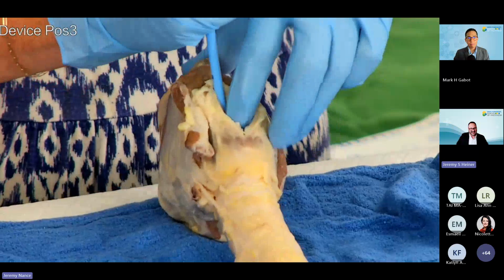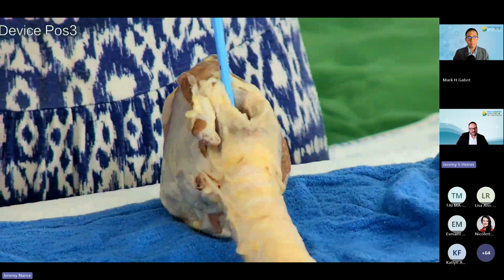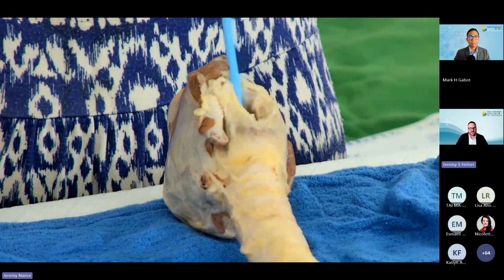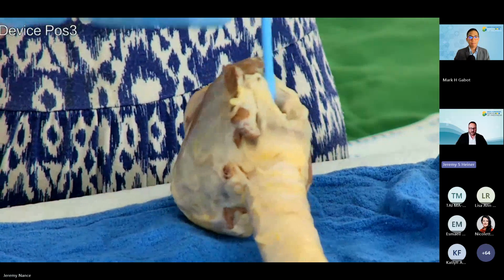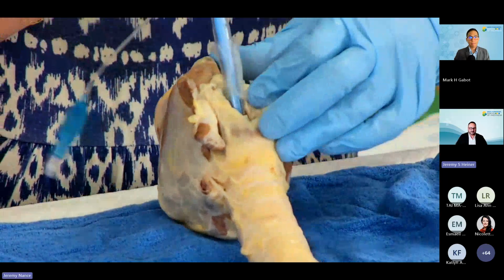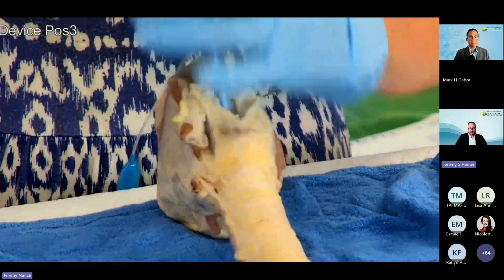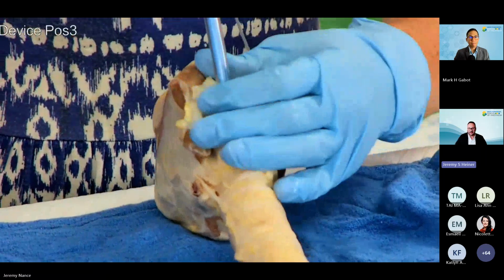There we go. I can see it sliding now. Yeah. I'm not sure, there may have been another really thin piece of tissue that we weren't all the way through, because that bougie absolutely went in a lot easier that time. Yes, and we've definitely dilated that opening.